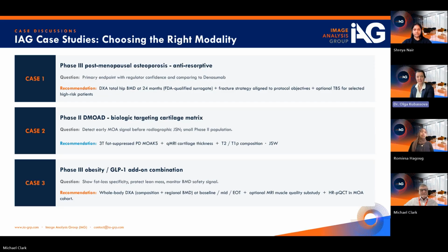Yes, happy to. So obviously there is a number of recommendations to go beyond joint space widths. This is really towards building disease modifying drugs in osteoarthritis. So we are looking at targeting different mechanism of action, and the endpoints should be appropriate. So there is a variety of studies starting now, and I like the new vision of osteoarthritis drug developers to really integrate better screening, more stratified populations, and look at the endpoints beyond just simple X-ray and joint space widths. And last case study, Michael, to you.